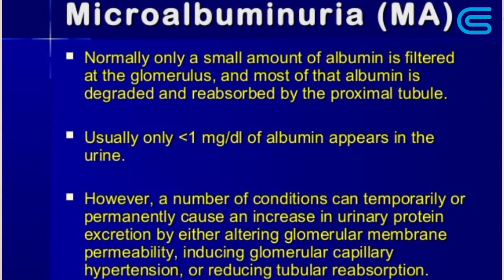The detection is by measurement of the albumin creatinine ratio in a random urine sample. The albumin is also taken very early in the morning or in a random urine sample. We can also measure albumin in a 24-hour urine sample, and use the test strip to screen for microalbuminuria. I said I'll speak of something on Bence Jones proteins.